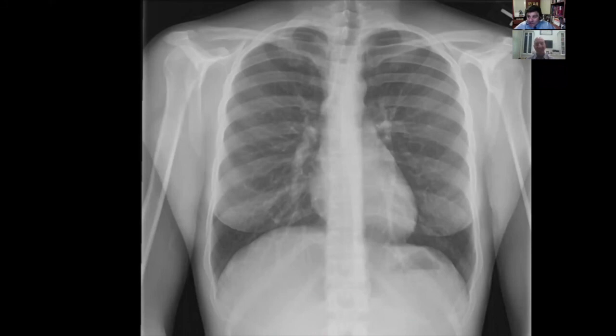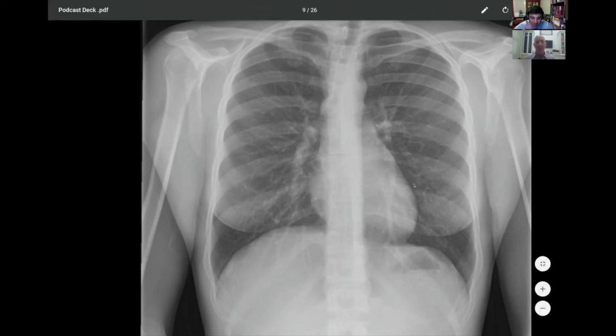No, actually, I love listening to your search pattern, how you go through that. You'd be surprised how few people really are systematic. Sometimes people just take a very passive approach and look at the film and wait for something to catch their eye. But I love the way you're going through all the different things that we talked about. You look at these hilar vessels, how straight and smooth they are.